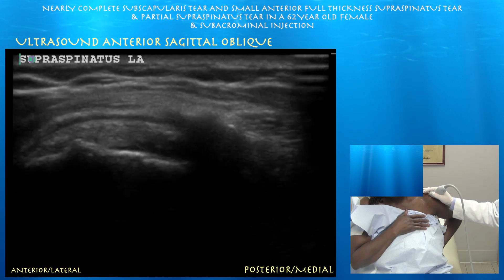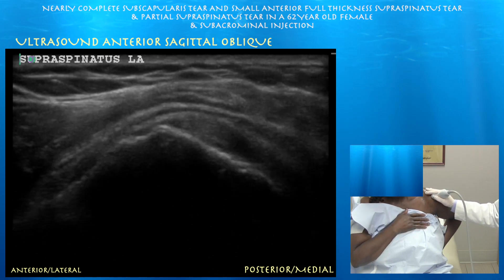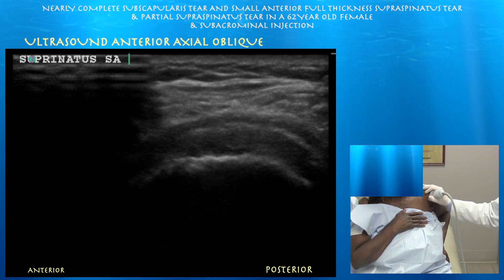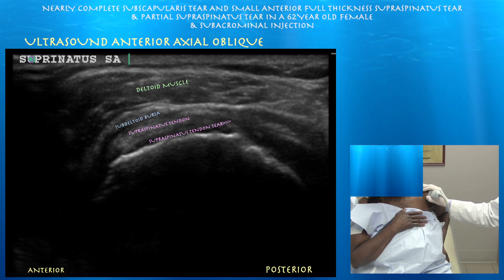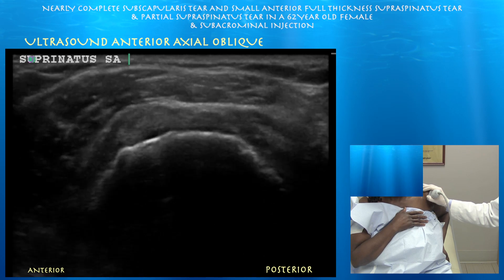Starting posterior at 1404 and going anterior — posteriorly the supraspinatus again looks fairly well preserved. Now in short axis: posteriorly, the thickness of the tendon is not too bad, and there is moderate subdeltoid bursitis. As you go anterior, you can appreciate this oblique linear tear in the anterior aspect of the supraspinatus tendon, with some thinning of the actual bulk of the tendon itself.